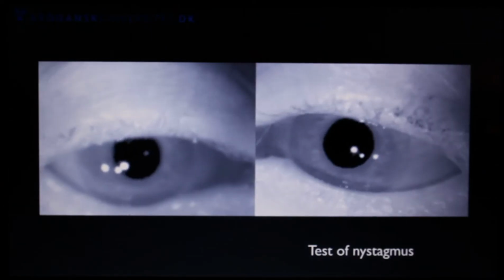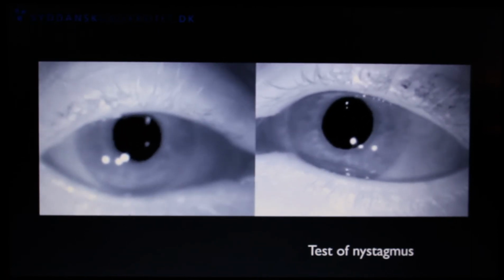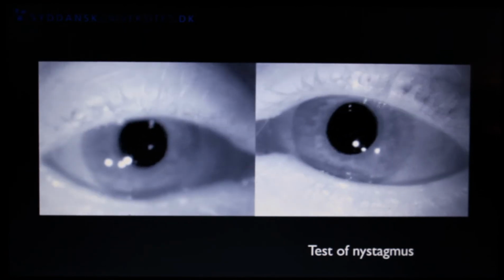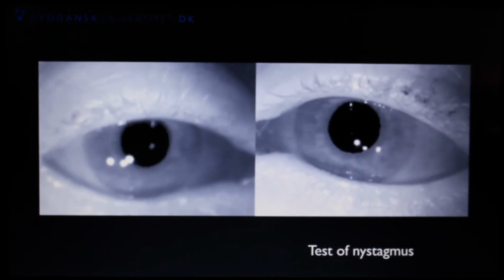The nystagmus is as severe, nevertheless you use Barthel's or Frenzel's glasses or not. The amplitude is large and the frequency is low. This video clip shows a high frequent nystagmus with small amplitude in a combination of left beating direction with a rotatory component, as seen in case of pathology in the inner ear or along or in the vestibular nerve.